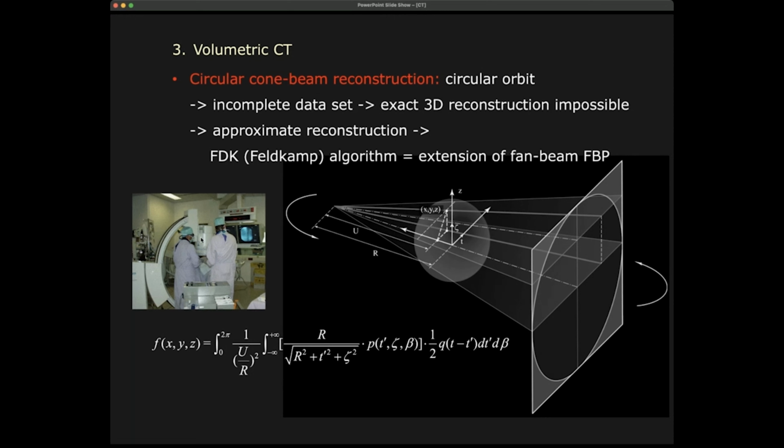With the fluoroscopy machine, we scan a cone. And if we have a digital version, we can scan it and then do a reconstruction. So you can actually do what's called a rotational angiography, for example, as we will see at some point, based on these machines. These machines are in principle made for real-time imaging, to do interventions, working with catheters to do surgery or something like that. But because they are projection, sometimes you would like to have a 3D reconstruction, and then you would do it.